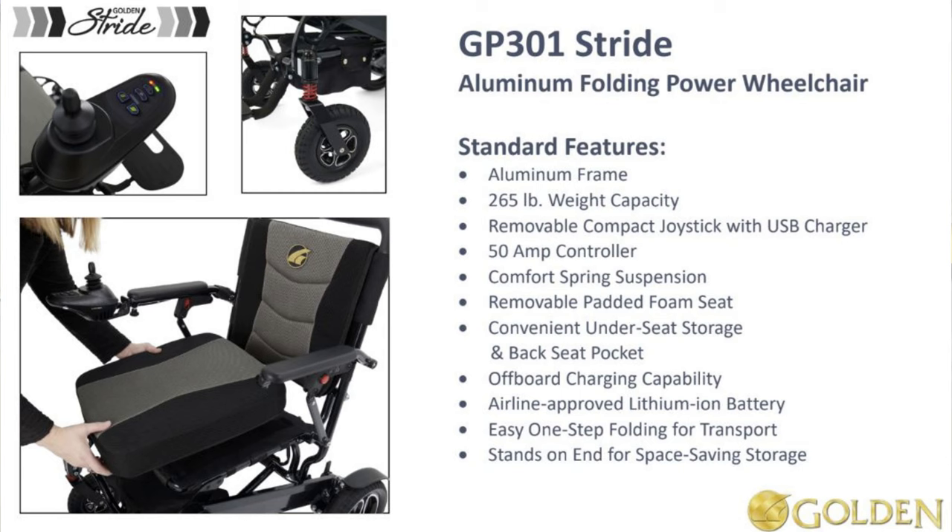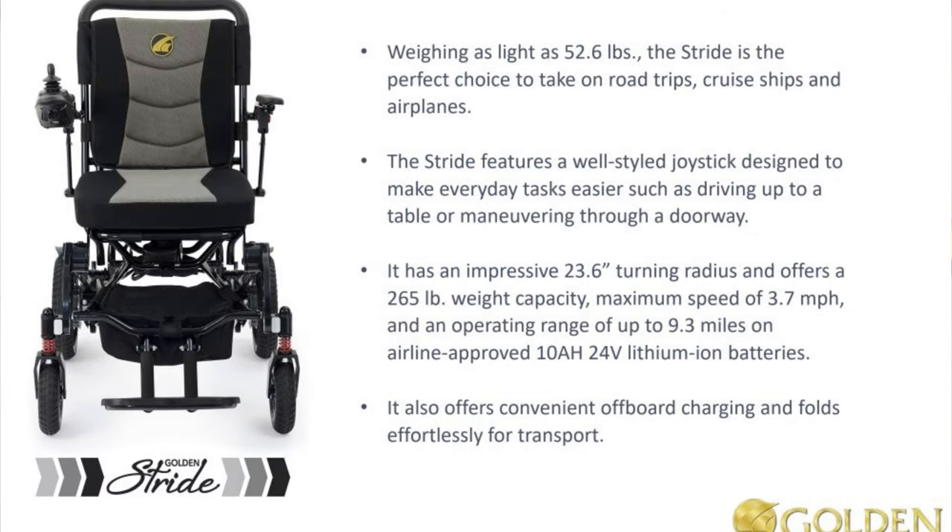It has an aluminum frame, can hold up to 265 pounds, and weighs 55 pounds completely assembled with the battery installed. The battery weighs about 5 pounds, so if you remove the battery, it's a little bit lighter.